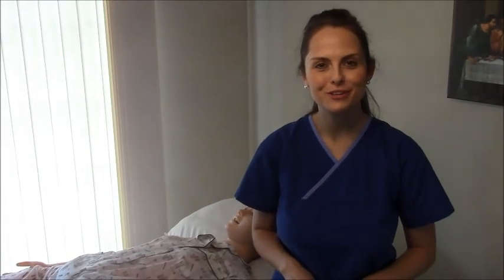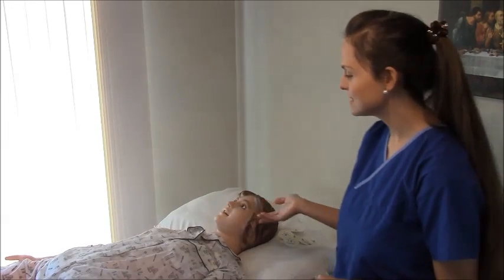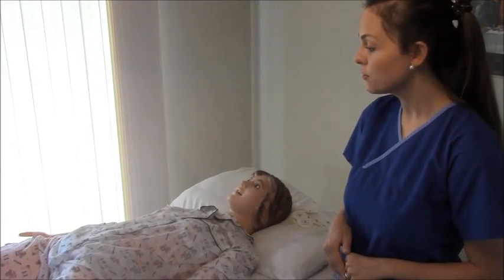Hey everyone, this is Sarah with RegisteredNurseRN.com, and today I'm going to show you how to prep for a 12-lead EKG. Here we have Ms. Smith, our mannequin, and I'm going to show you how to place your leads on, how to prep the skin, and show you how you get one.